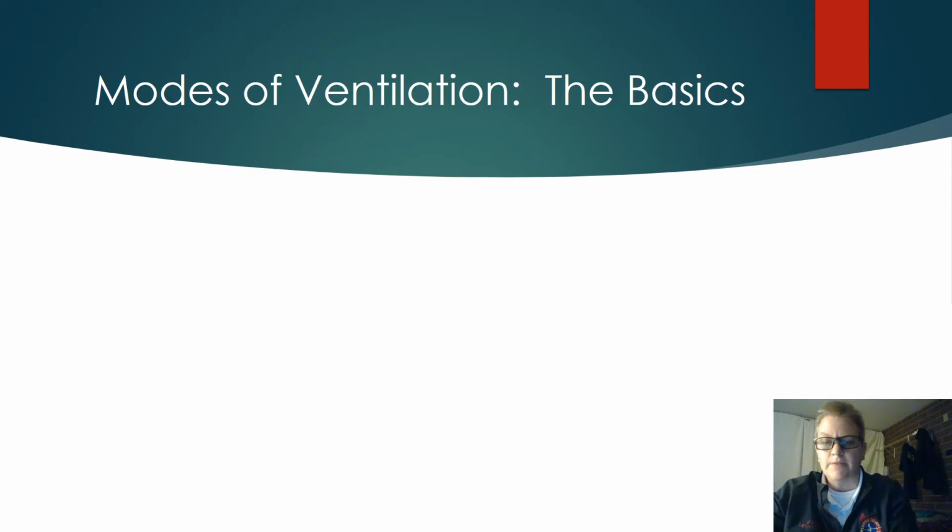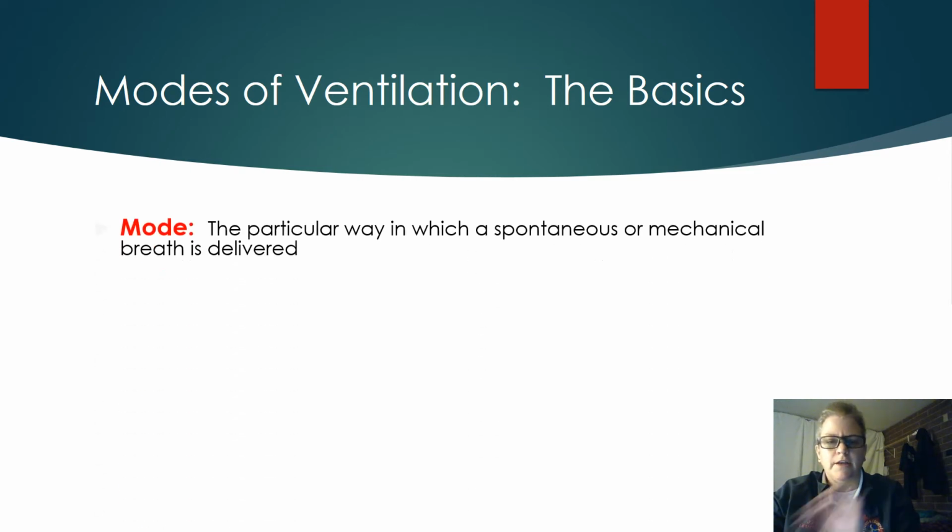Okay, let's talk about some of the basics for modes of ventilation. The mode of ventilation is the way that the spontaneous or mechanical breath is delivered. I'm not going to talk about some advanced ones like pressure regulated volume control or airway pressure release ventilation, the high frequency ventilation that they use on neonates, the jet ventilation and all that sort of stuff.